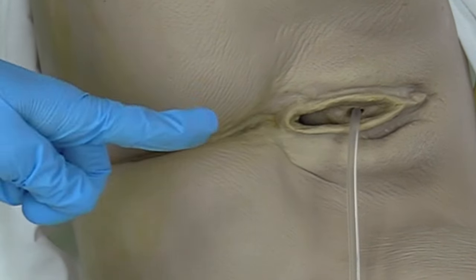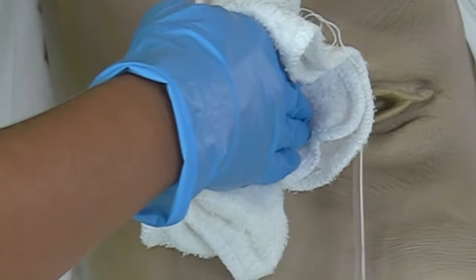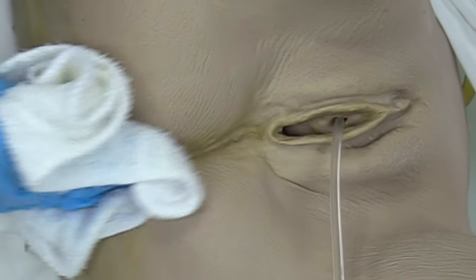And then now we're gonna go over the anus. So we're gonna go from front to back, cleaning that area, pull back that leaf on our last leaf, and front to back. Then we're gonna discard this and get a cloth with water. Now we're gonna rinse with our new cloth in the same motion.